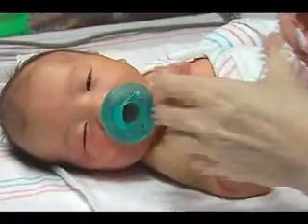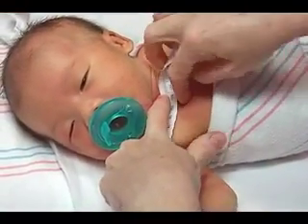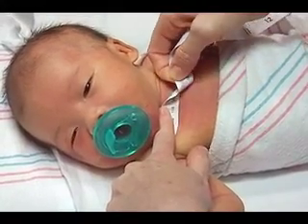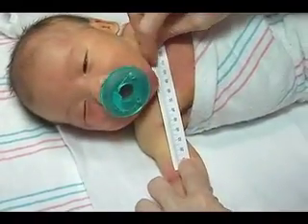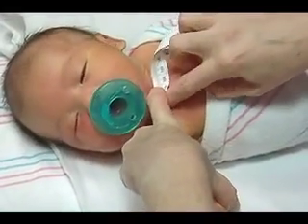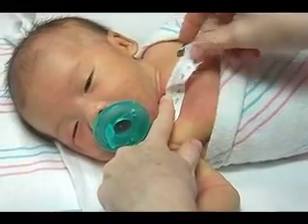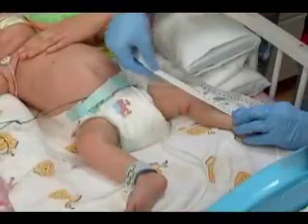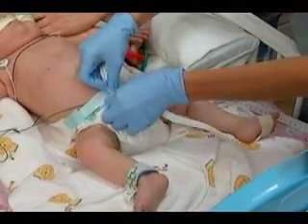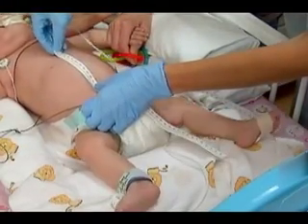Determine the location for insertion of the catheter and measure the anticipated catheter length. Make note of the centimeter distance. You will use this centimeter measurement to guide catheter placement depth. For arm or scalp insertions, measure from the insertion site along the course of the vein to the right sternal border and to the level of the nipple line or third intercostal space. For insertions into the leg, measure from the insertion site along the course of the vein to the level of the diaphragm.